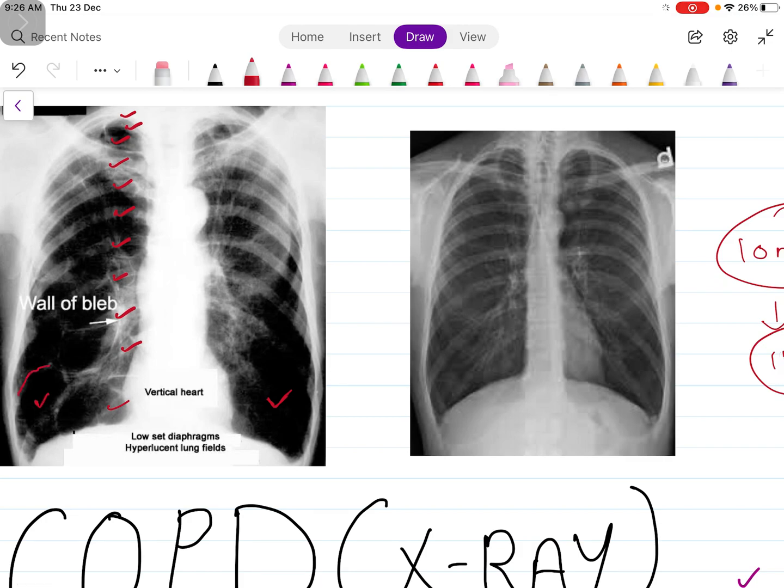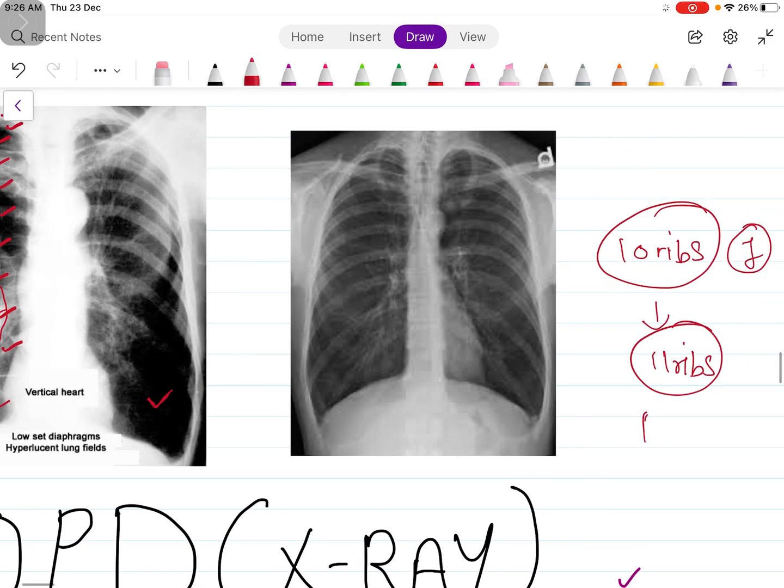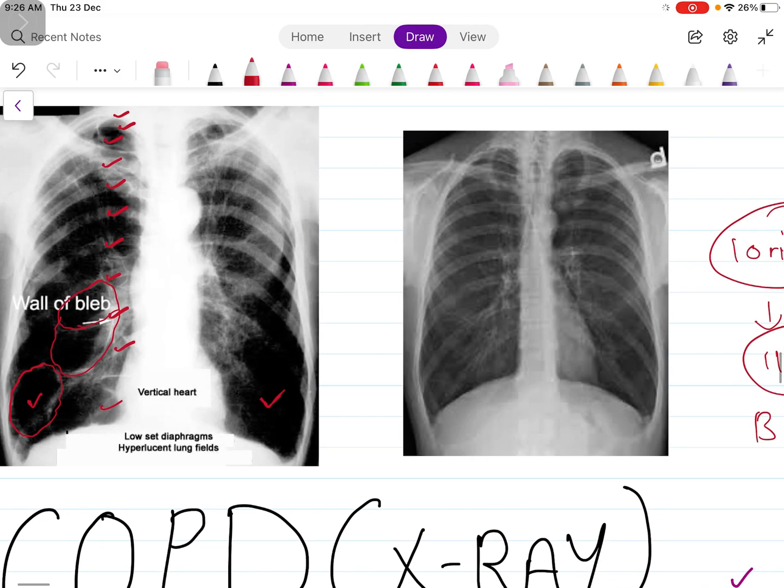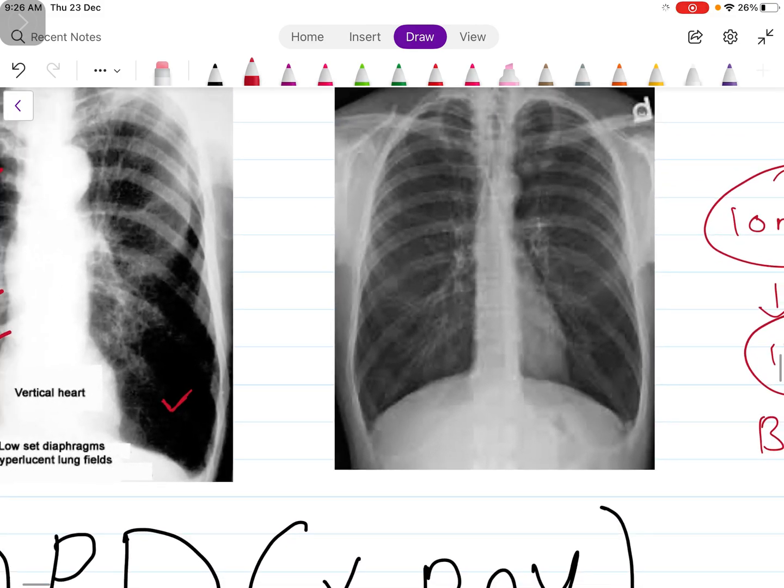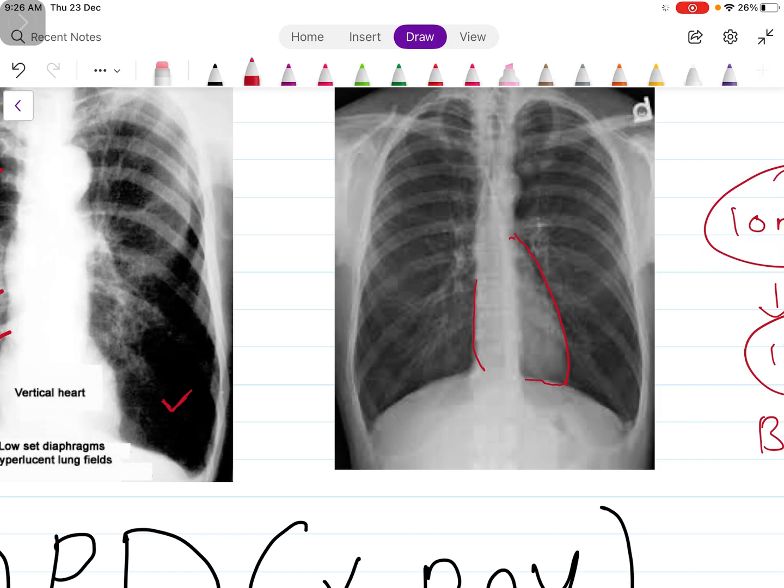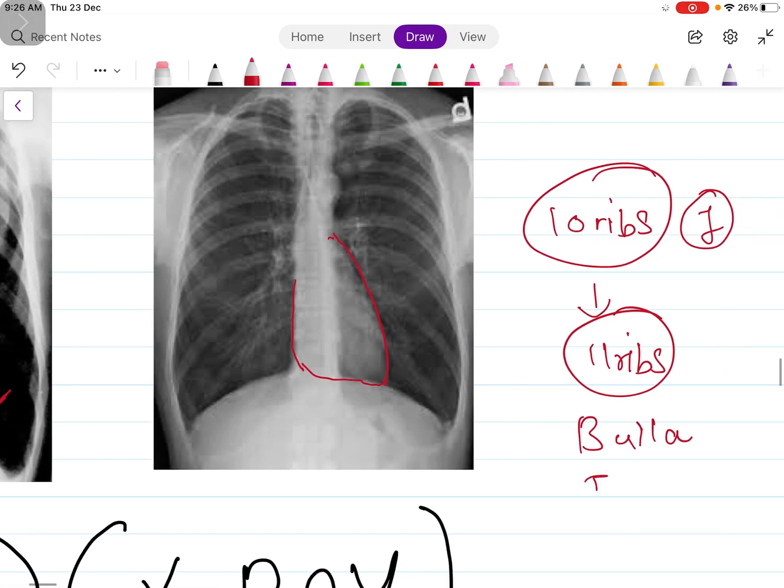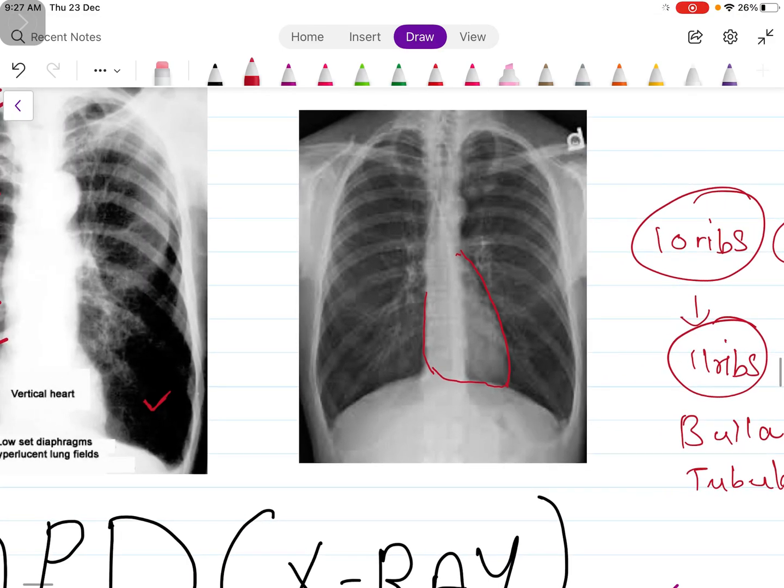And you can see the blackness over this area. You can see this lesion, this is the bulla. You can even see here this is the wall of the bulla and there is a large bulla here. So there are bullae present. Then other thing we can see is the heart, it has almost become tubular and small. So again we got our other point, that is tubular heart.